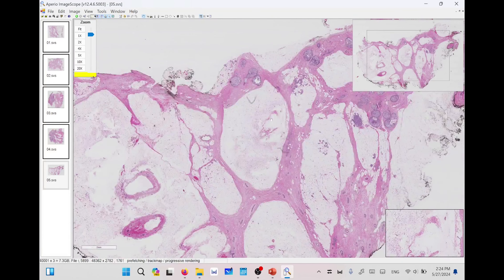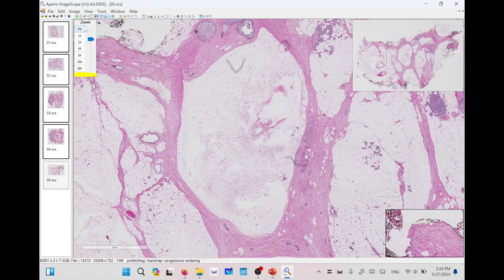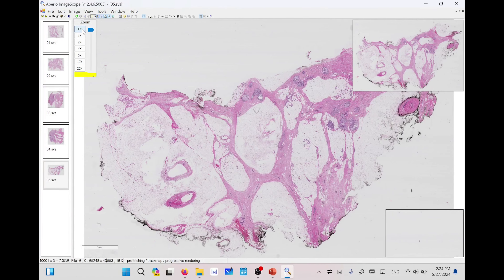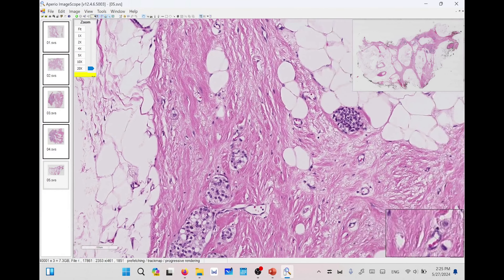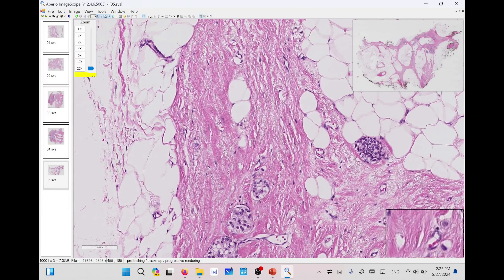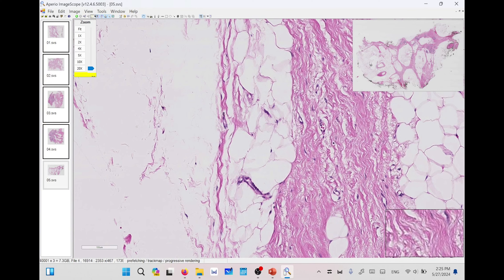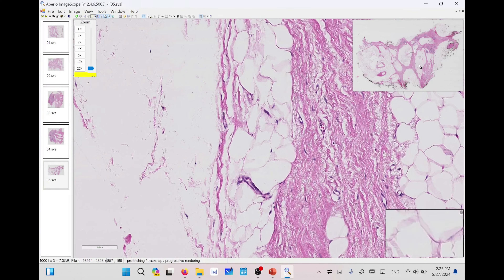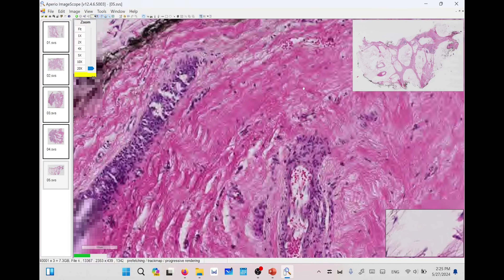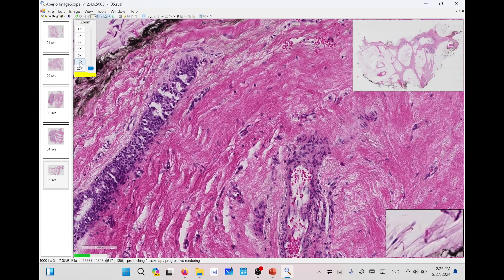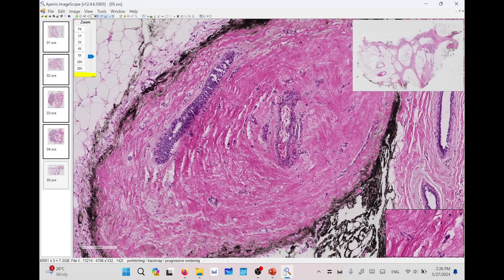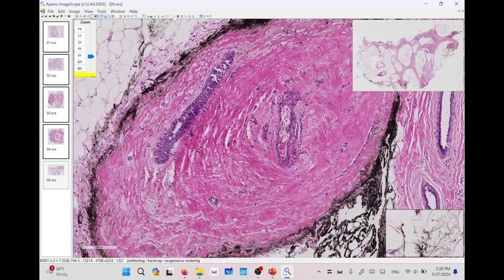You can zoom in and zoom out using two options: the first is using the mouse scroll wheel, and second, you will find different zoom levels from fit to include the whole slide image on your screen, from 1x up to 20x. By dragging the whole slide image using the left click of your mouse, you can navigate and scroll to any region. You also have a small thumbnail screen — you can press on any region to easily navigate to it, for example navigating to 10x or 4x.